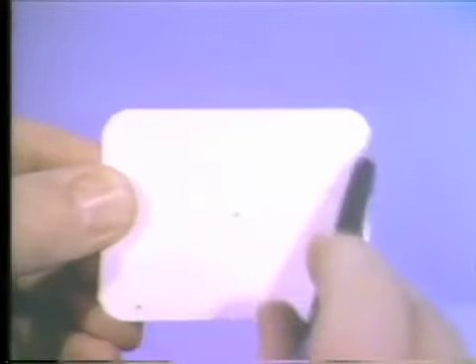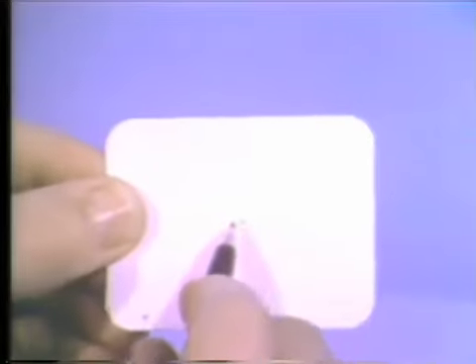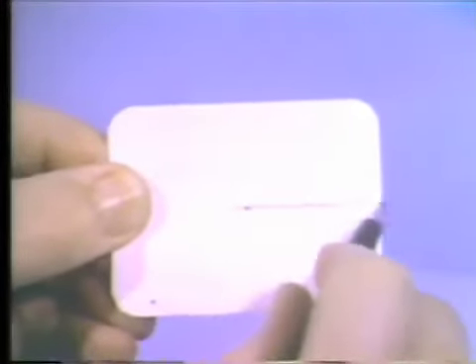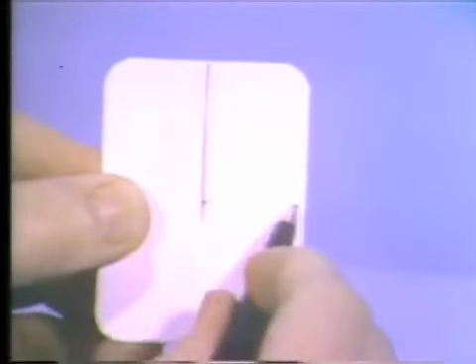Correctly aimed at this center, the X-ray beam will expose all margins and corners of the film. Since the center dot will be hidden when the packet is positioned inside the mouth, we draw in some guidelines that will aid us in the alignment of the central beam. This is being prepared for a right posterior maxillary occlusal radiograph.